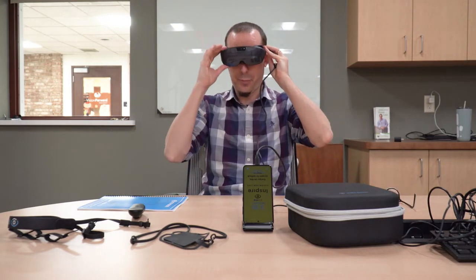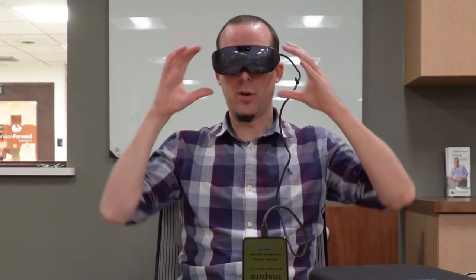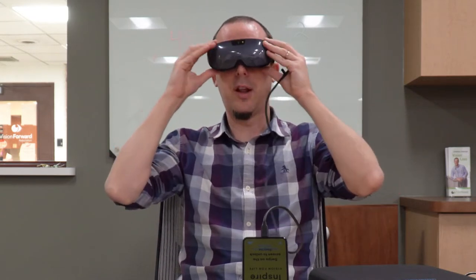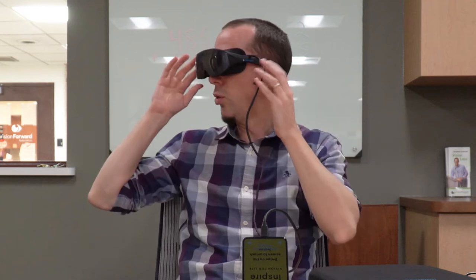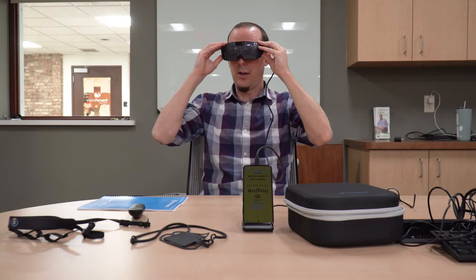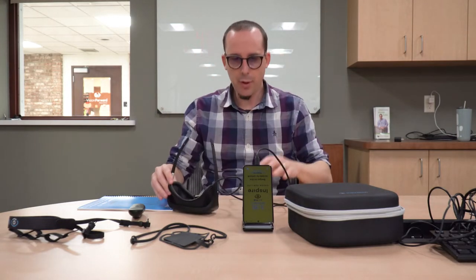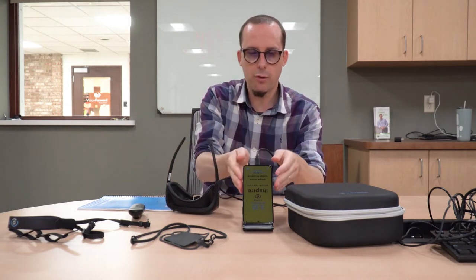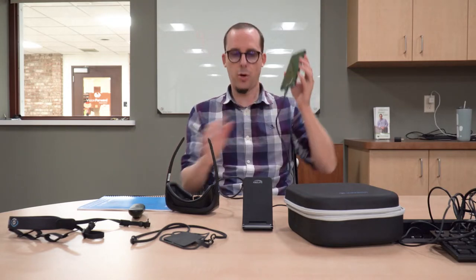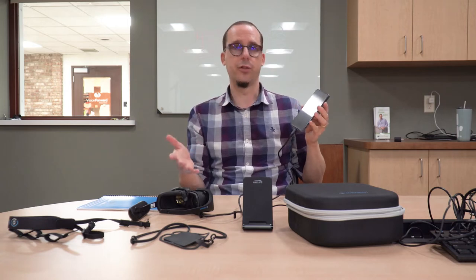Putting this on, it looks a lot sleeker than the IrisVision Live - more like sunglasses. It's kind of larger and deeper than regular sunglasses, but it does look a lot cooler than the IrisVision Live. We do have a camera in the front and screens on the inside, as you would expect. But the image processing is done on the phone, which is tethered to the glasses by a cable in order for the glasses to work.